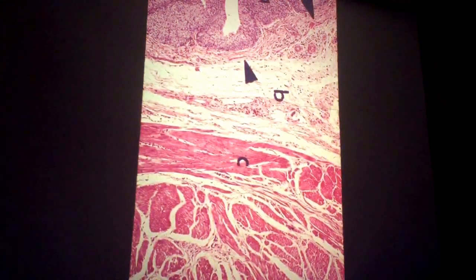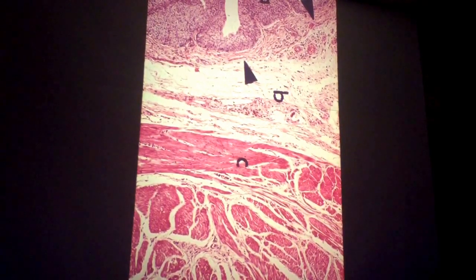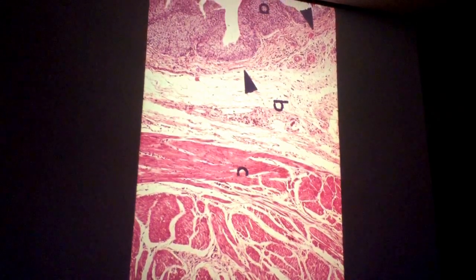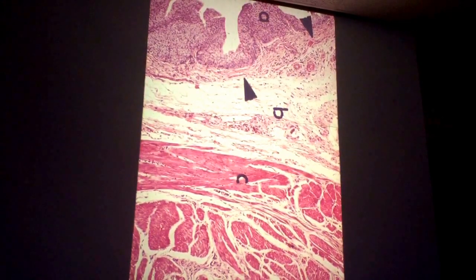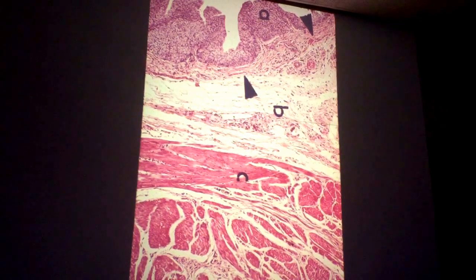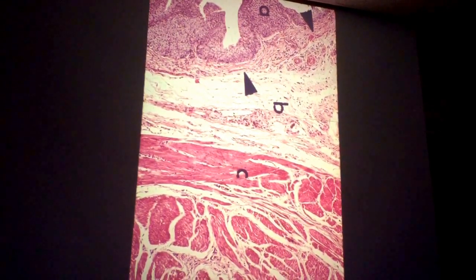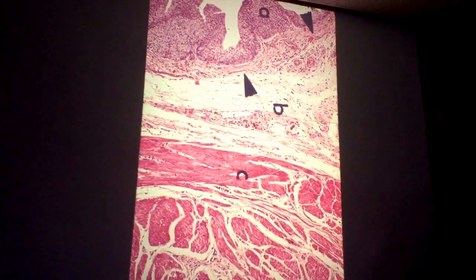And this is a little bit unfair. Would not be quite so unfair in the lab practical where you could move the slide, but this organ is what? This is bladder. Okay, and you'd be able to move that around for organ identification in most cases on the lab practical. The question will tell you whether or not you can move the slide and change magnification.